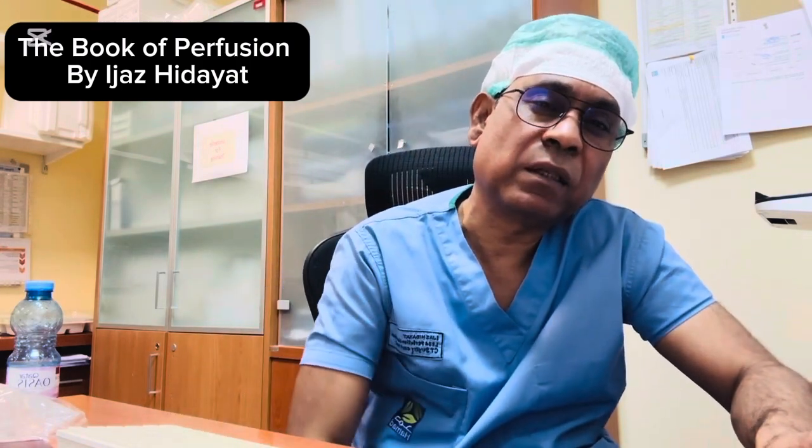So if you prime your ECMO machine, it is valid to activate for ECPR within 30 days. The ECMO trolley should be ready. You should always be ready with your insertion kit, with your cannulas, with the needles, with the guide wires. So we have to prepare the ECPR kit, and we need to prepare the equipment.